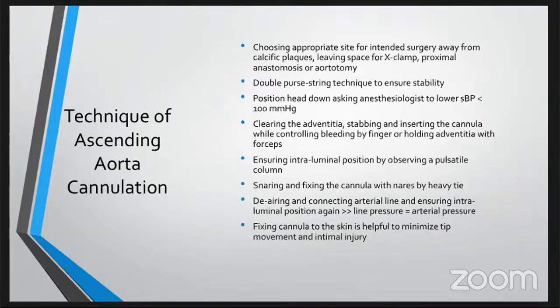It's important to mention that too much advancement of the cannula might injure the aortic back wall.